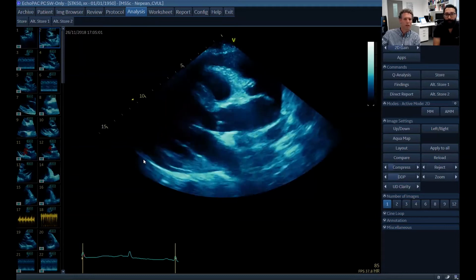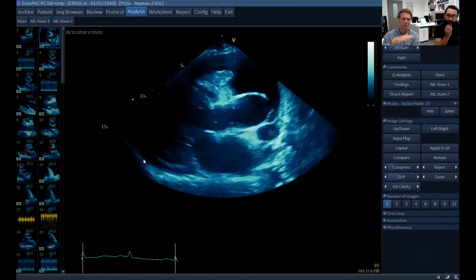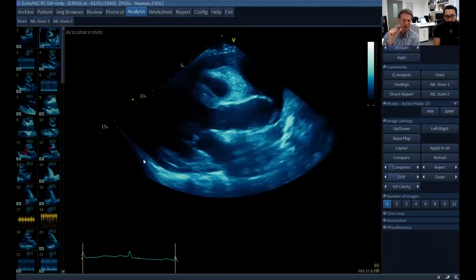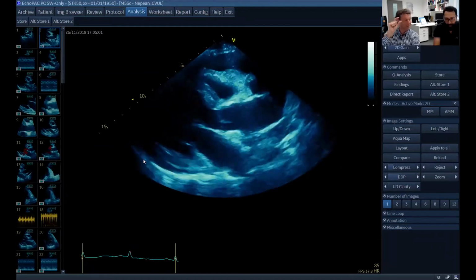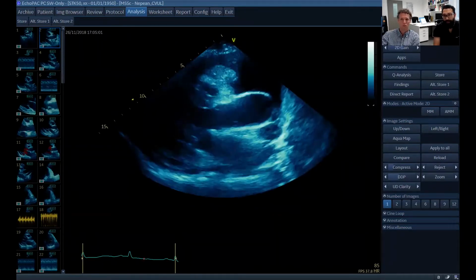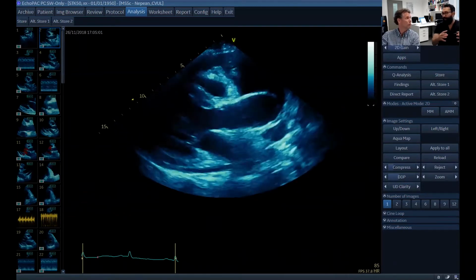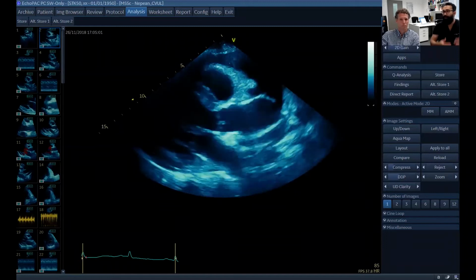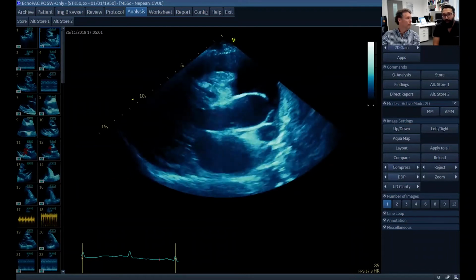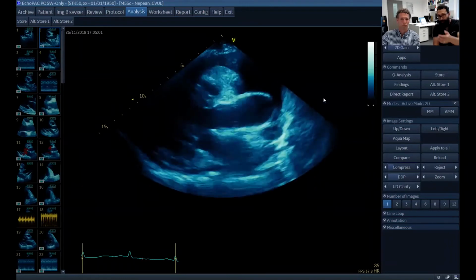Nice. Okay, next question would be the size. I've read the books. They tell me that to measure the size of the pericardial effusion, I've got to measure it at end diastole in the greatest area possible, perpendicular to the heart. Does that sound about right? I think that's completely fair. And this is where you find that CTs can often overcall the size of effusions because they're tangential, non-echo planar cuts. So we often get referrals for large effusions, which end up being small to moderate in size when you actually put an echo probe on them. Having said this, perpendicular to the heart, this does look like a large effusion with something quite concerning, which we'll obviously come to.